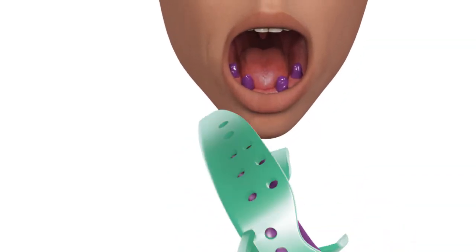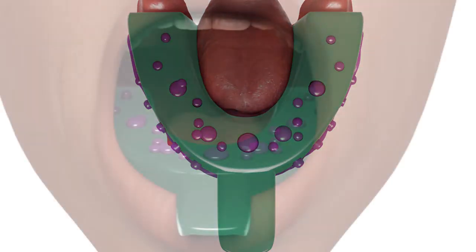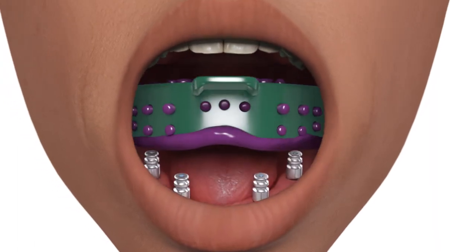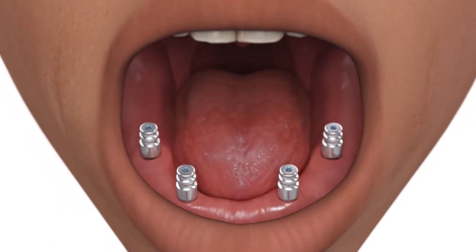Load the impression tray with material and make the impression. Once the impression material has set, remove the tray. The indirect copings will remain in the mouth.